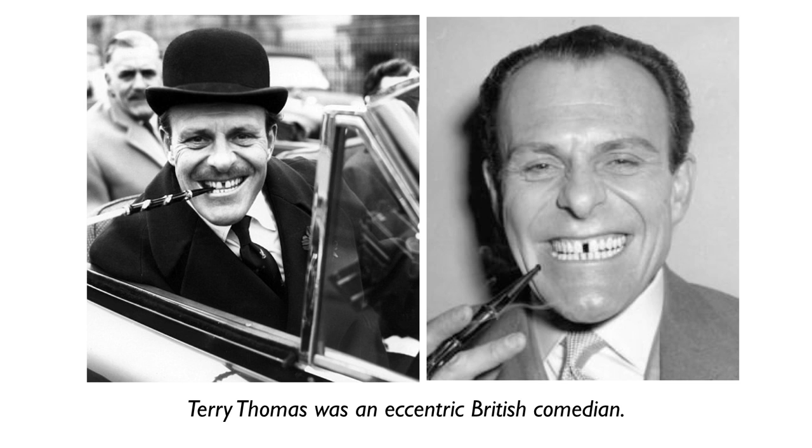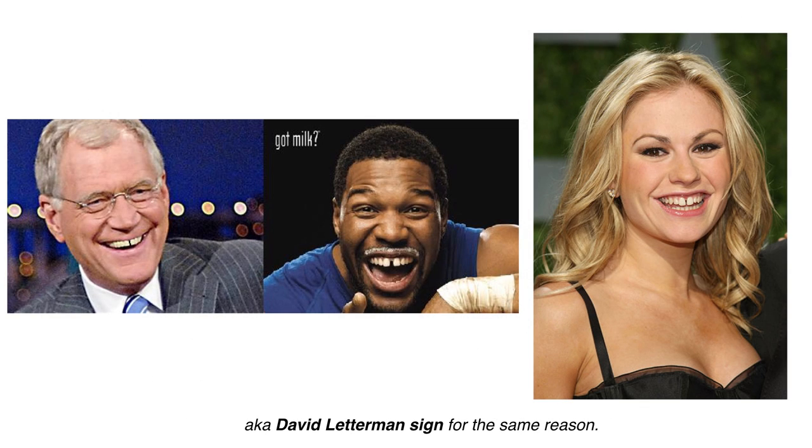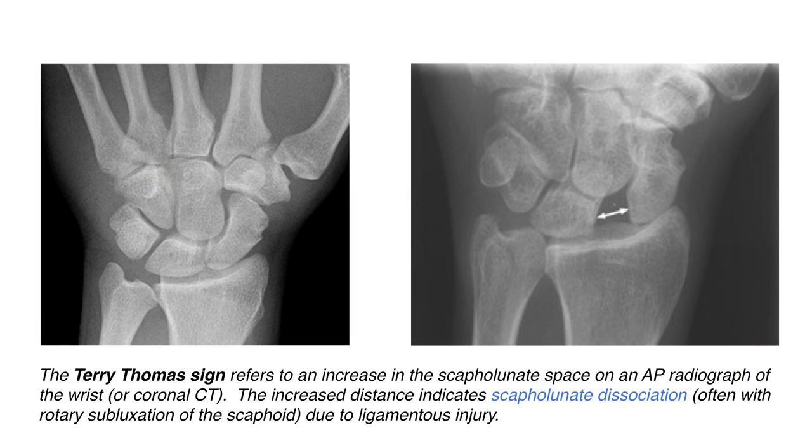The sign is called Terry Thomas' sign. Terry Thomas was an eccentric British comedian. The sign has also been termed David Letterman's sign, but it could also be termed a whole bunch of different things since there are a lot of celebrities with that finding. The common denominator is the separation between the two front teeth. Of course, there are no teeth in the wrist. If you look at the left picture here, that's a normal x-ray of the wrist. At the right, you can see the arrows pointing to a separation — a widening of the two bones, the scaphoid and the lunate.